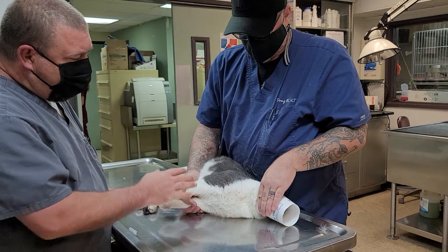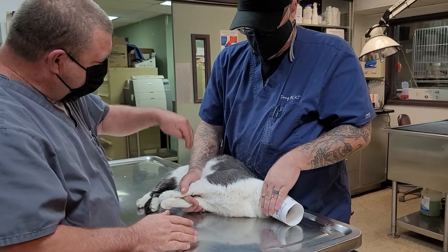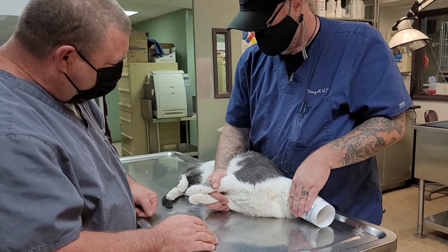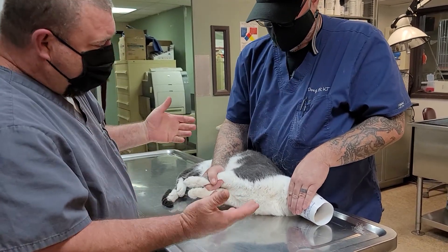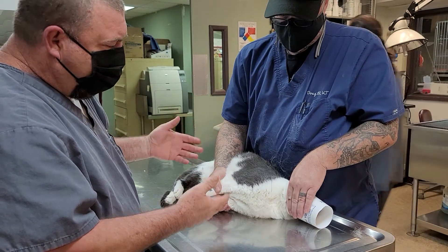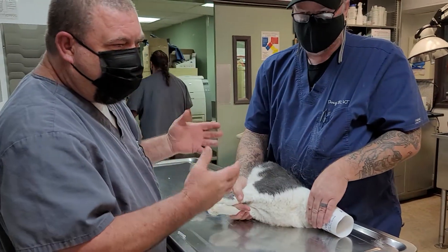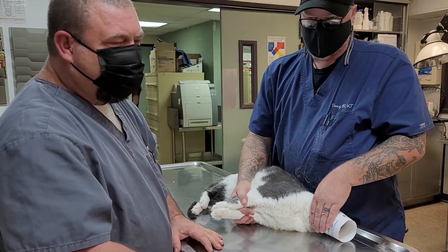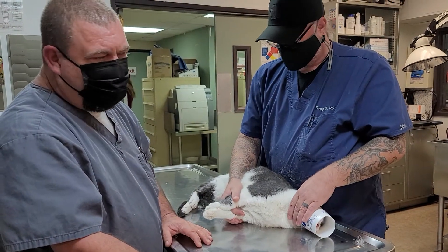On this position, keep your arm in front of the pelvis so the legs don't scratch you. It's a very gentle way to do it, and cats tolerate it very well. All this over-the-table stuff just doesn't work well.